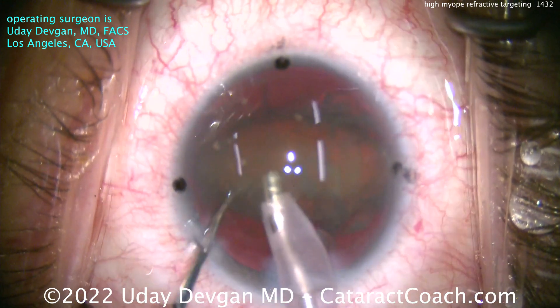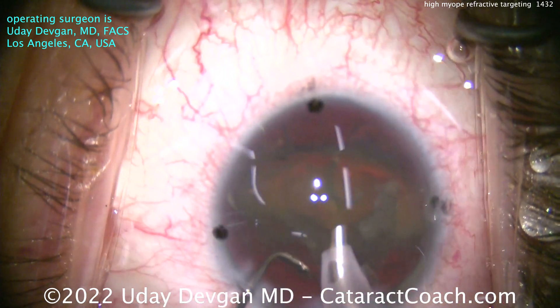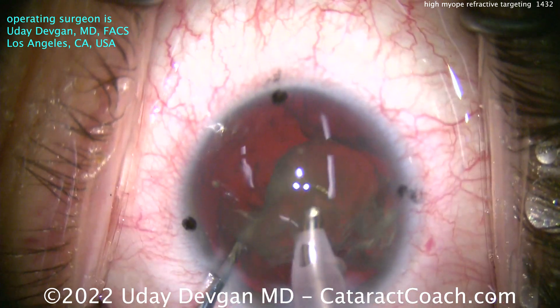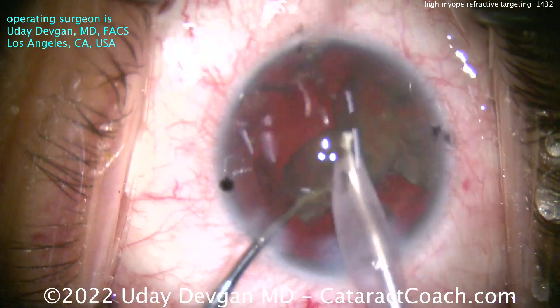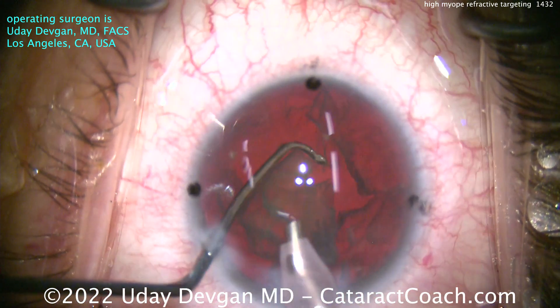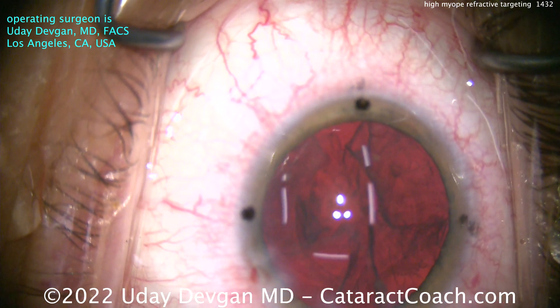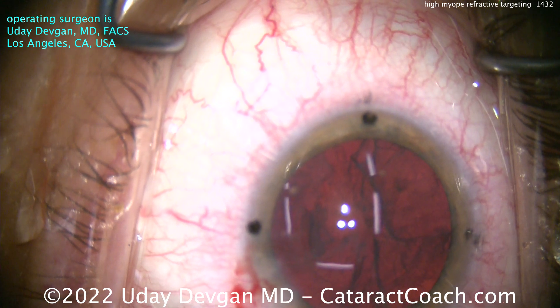Look at the video right there. Where's the iris? Why has the iris disappeared? Because that's reverse pupillary block — commonly seen in these ultra-myopic eyes with a very long axial length. I'm using it a little bit to my advantage to just get that nucleus out of the eye. Not a very dense nucleus in this case, so being very cautious. Look at the position of the chopper — the smooth end is down, the safety position. Because I don't want that capsule to come forward. If you break a capsule in an eye that is ultra-myopic and get vitreous prolapse, the risk of retinal detachment or retinal complication is much higher — many times higher. At all costs, try to avoid that.